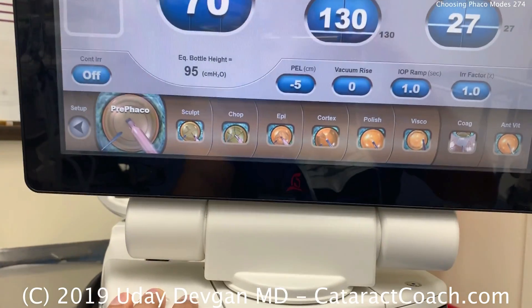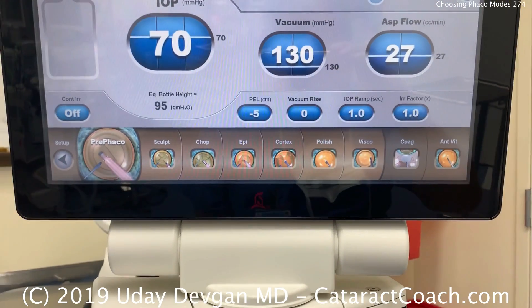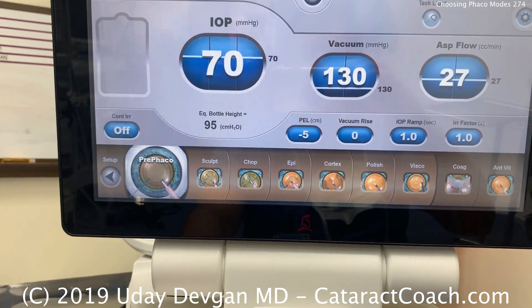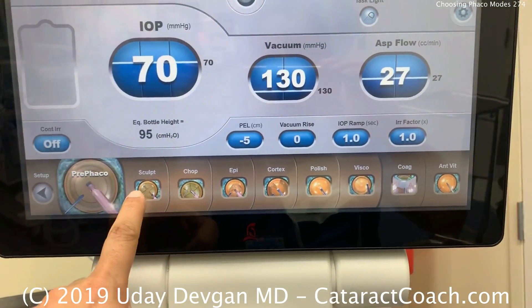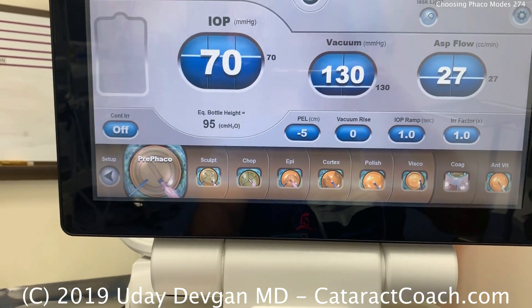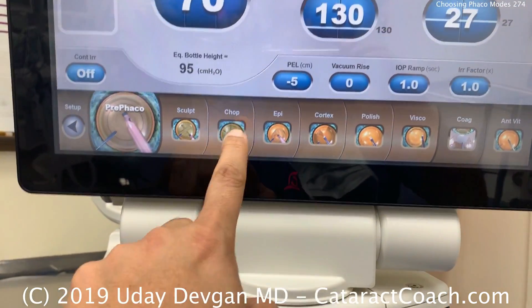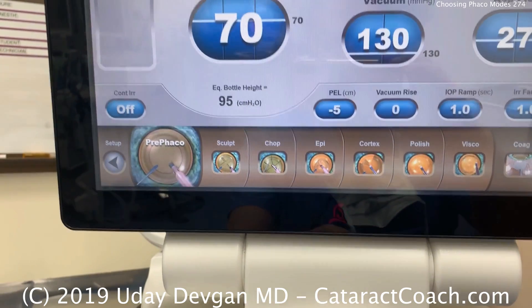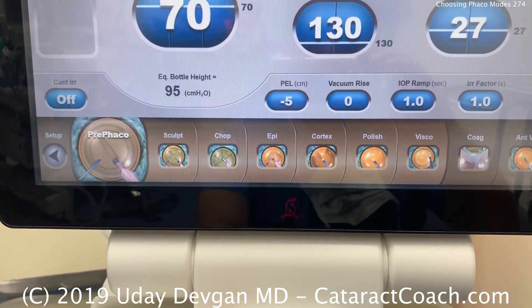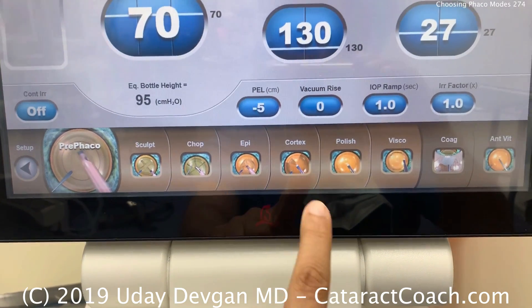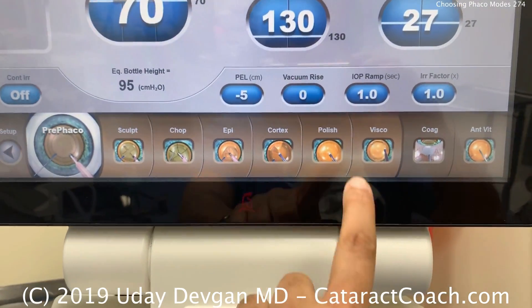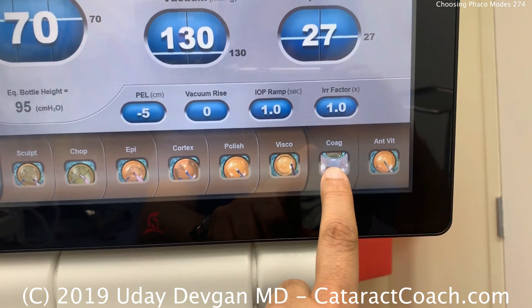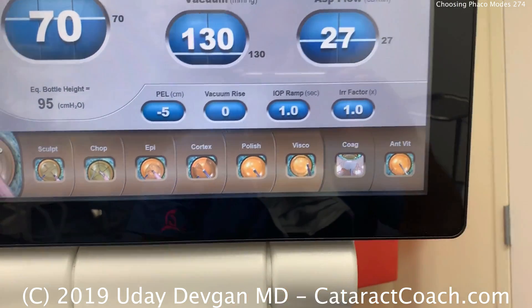On the bottom here, let's go through the various modes one by one. First we've got pre-FACO, which is typically used to remove anterior cortical material. Next comes sculpt — to make a groove like in divide and conquer or stop and chop. Then chop, to remove quadrants or hold the nucleus for chopping. You could also have a quadrant removal mode, but they're very similar. Epi would be epinuclear, to remove that epinuclear shell. Cortex to remove the cortex during irrigation aspiration. Polish to clean up the lens capsule, then viscoelastic removal. We also have backups for coagulation if needed, as well as anterior vitrectomy.